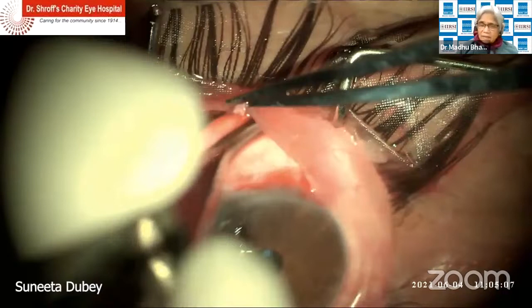They are counted and they go really posterior, covered nicely with the conjunctiva. While washing, the water should not be sent with too much force, because sometimes the mitomycin actually gets underneath the Tenon. It becomes swollen with that, and those little air bubbles come up. So it has to be a very gentle wash, and in the end, take two Johnson buds or sponges and pull out all the water which collects behind, because towards the fornix there's a lot of collection of water sometimes.